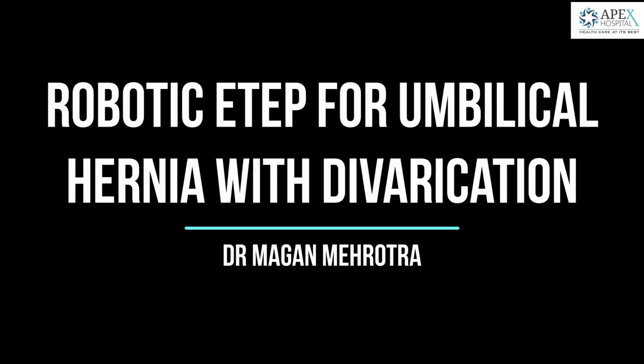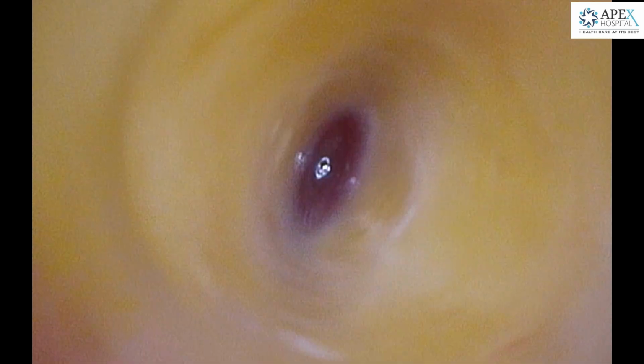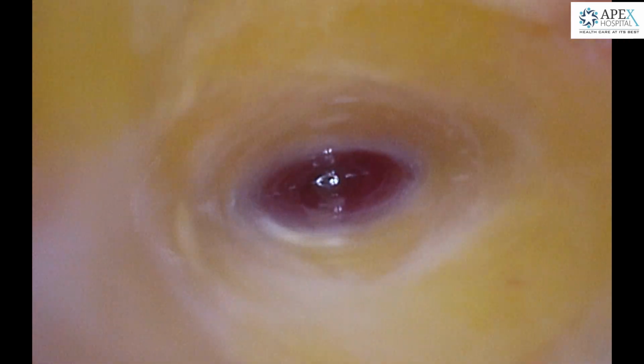Greetings from Apex Hospital. This is a case of 2 centimeter umbilical hernia with divarication M2 to M4 and W2.